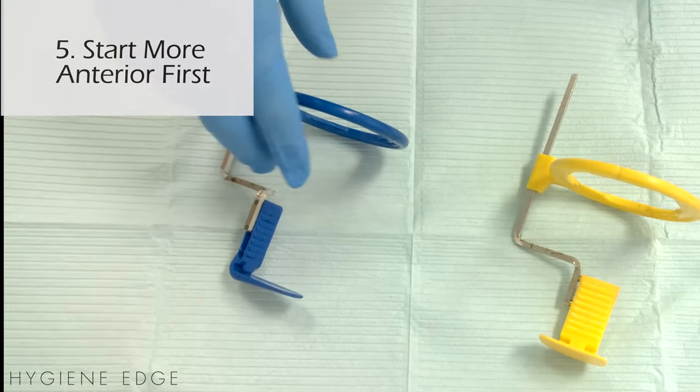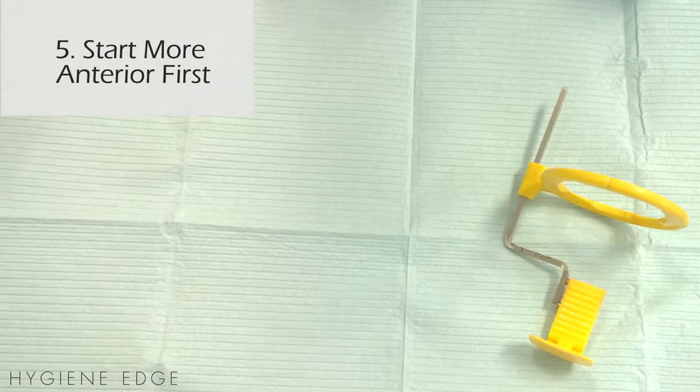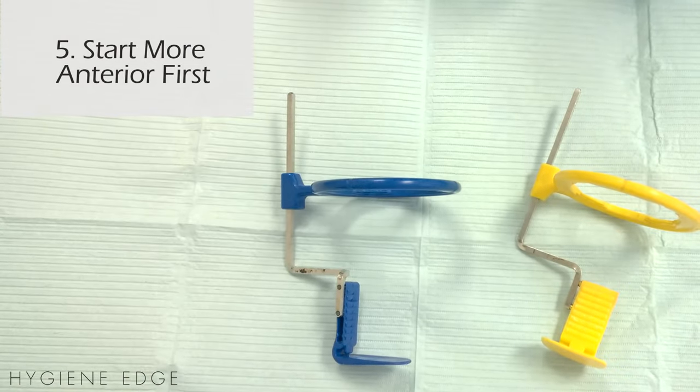Start with the more anterior radiographs first. So if you're doing a full mouth, start on the anterior teeth. If we're doing just bite wings, start more with the premolar shot.